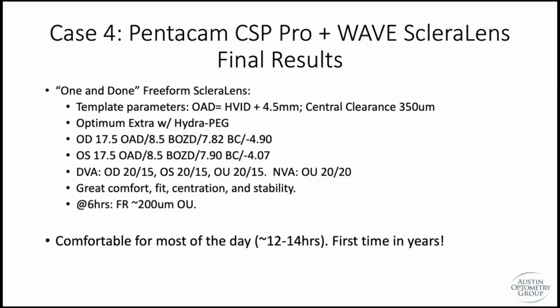Again, 20/15 vision through these lenses, and comfort for most of the day, which is a pretty big win in this particular patient's situation. 12 hours is a big accomplishment given the severity of her dry eye.